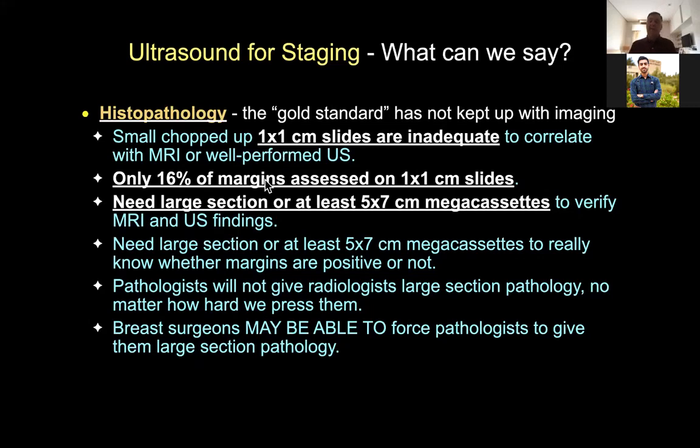And part of the reason ultrasound and MR are accused of overstaging is not that they're really overstaging, but that the 1x1 slides are understaging. And part of the reason TNM hasn't been improved is it's still based too much on 1x1 slides and clinical findings and not enough on imaging.